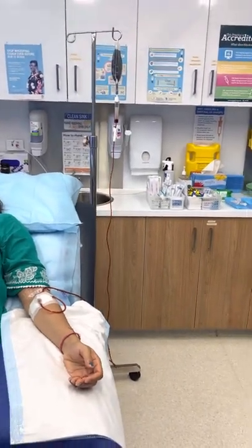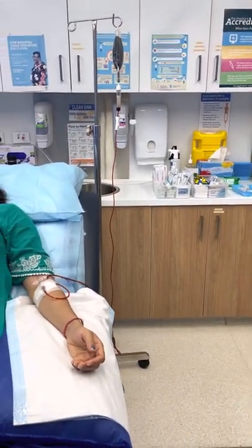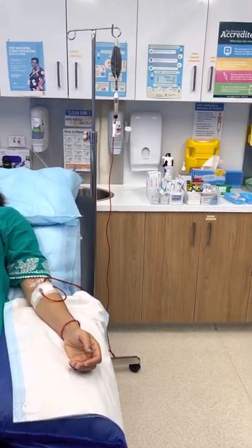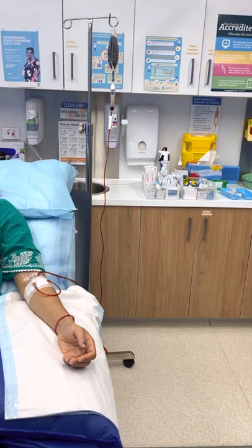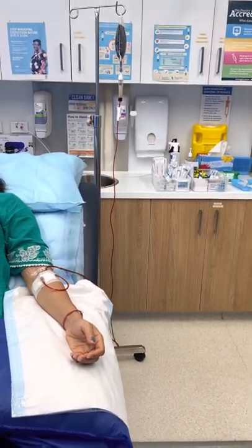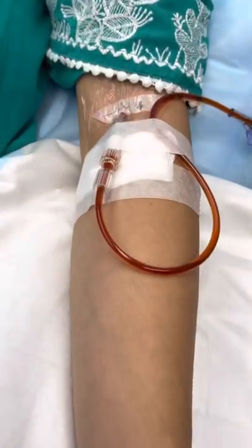This video is about iron infusion. We have a 35-year-old lady who presented with chronic tiredness, and blood tests showed she has very low iron. She has come here for an iron infusion. As you can see, we have popped in a drip into her left arm.